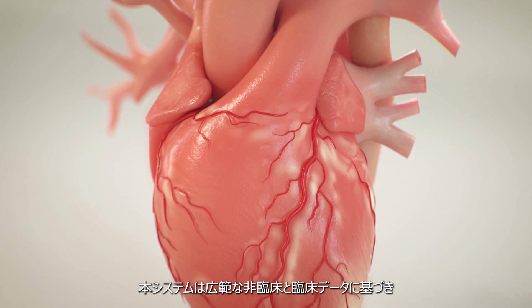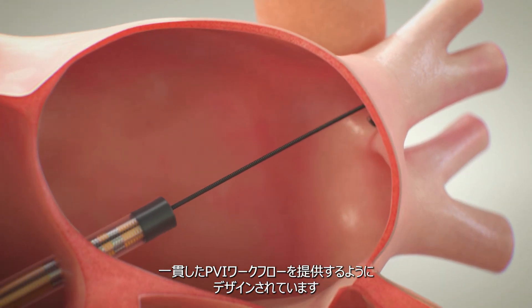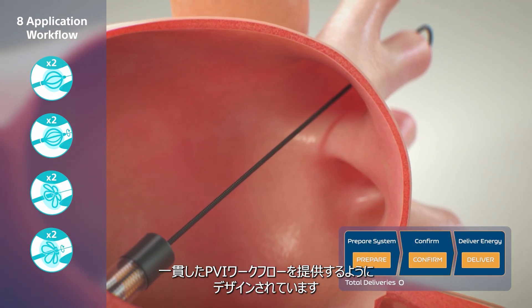Supported by extensive preclinical and clinical data, the Farapulse PFA system is designed to offer a consistent workflow optimised for pulmonary vein isolation.